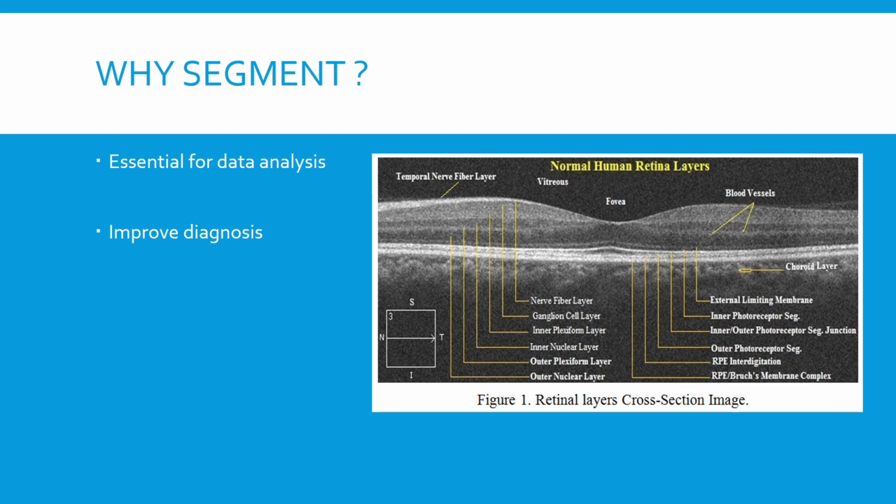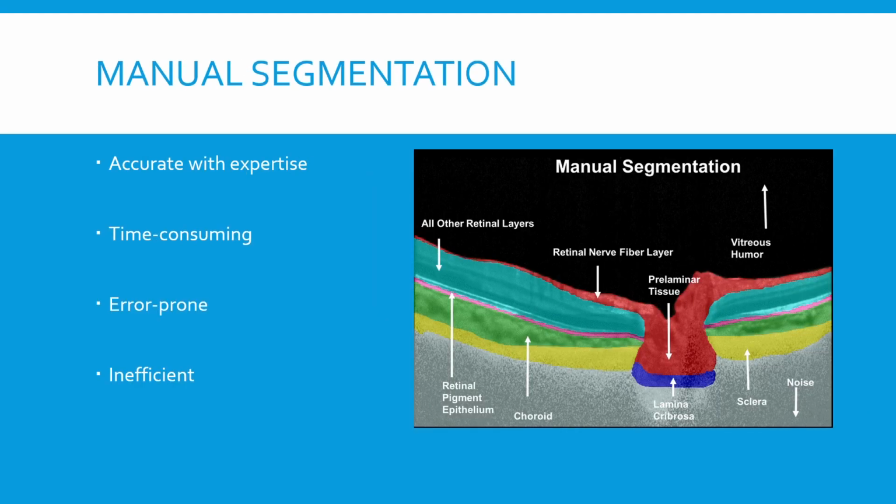In our case, it allows us to clearly identify the regions of the eye that are necessary for more accurate diagnosis. For example, it can help with earlier detection of ganglion cell loss, allows for the comparison of retinal thickness, gives volumetric measurements in the whole scan, and allows for calculation of similarities between the left and the right eye. So how's this done normally?